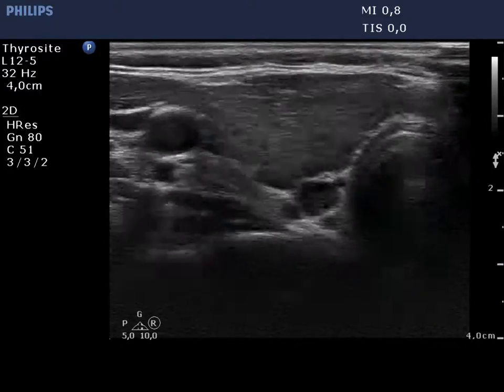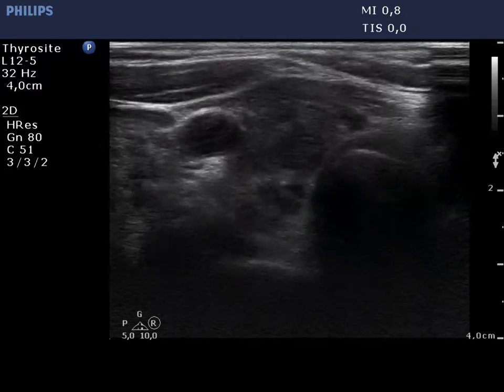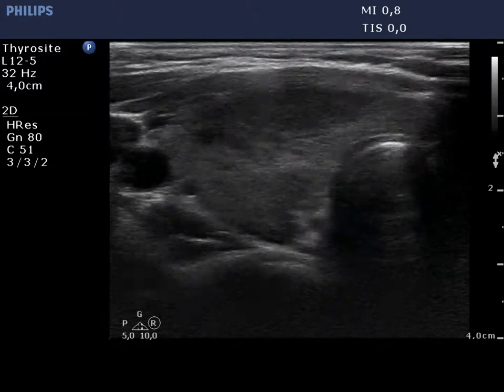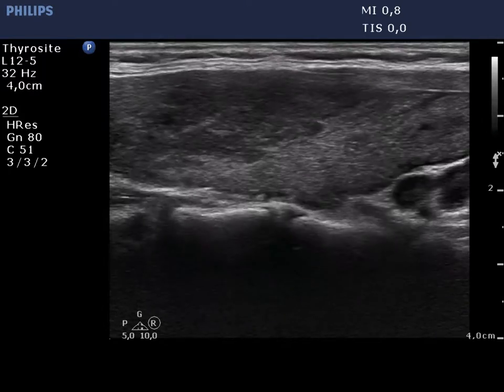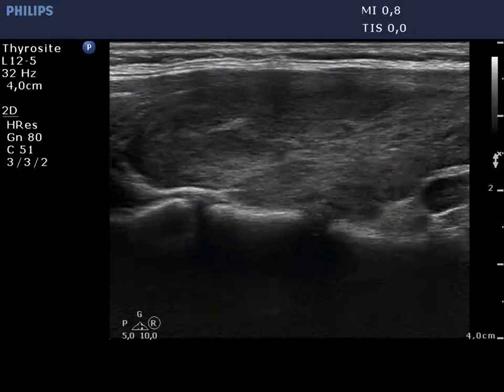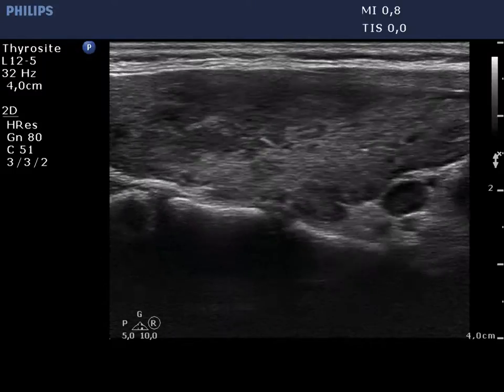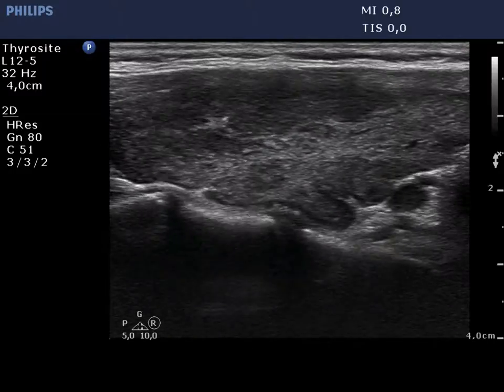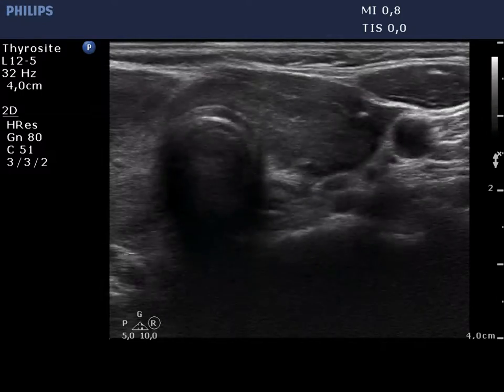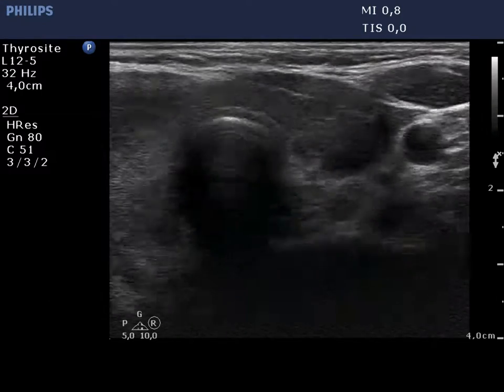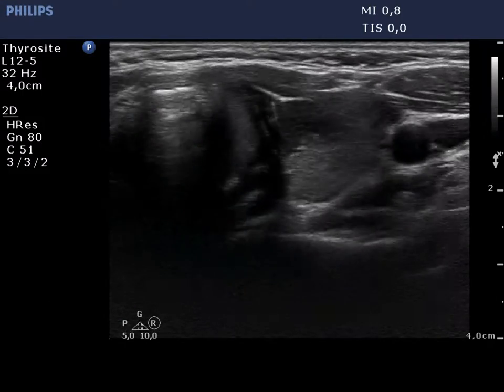The right lobe is composed of hypoechoic and isoechoic (echo-normal) fields, which are clearly not pathological nodules. The borders of the discrete hypoechoic areas are partly blurred, partly puzzle-like. The left lobe has a similar presentation.